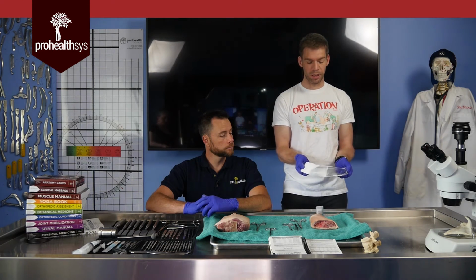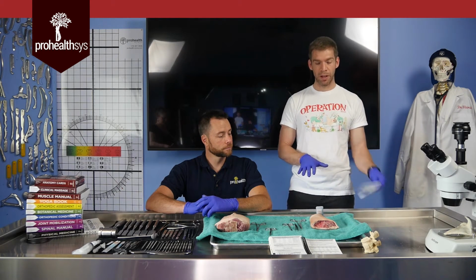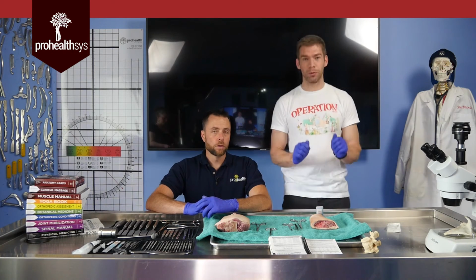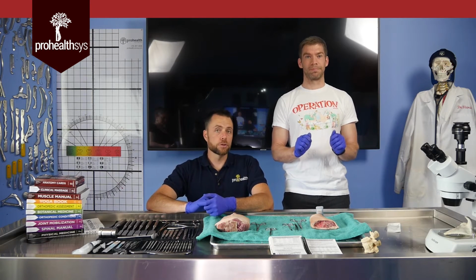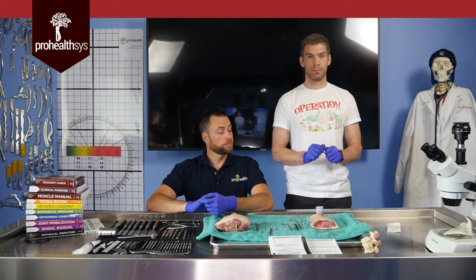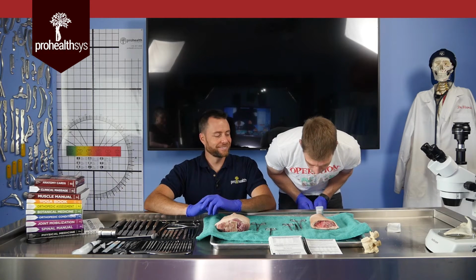As it opens, it naturally flips onto your sterile field, and I've kept everything kind of clean. As I work, I'll try not to put my face over top and breathe on the wound. That's a big no-no. You wouldn't even realize it, but just simple gravity, all kinds of bacteria and other potential microbes falling from you could get in there and cause an infection in that region. You're going to be tempted to look, am I close enough? You're definitely too close. You're bacteria close.